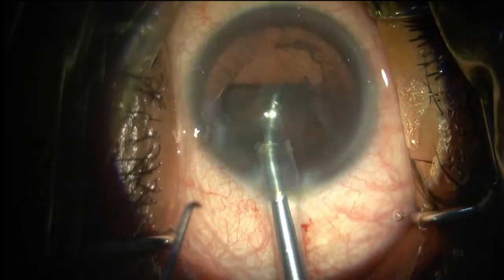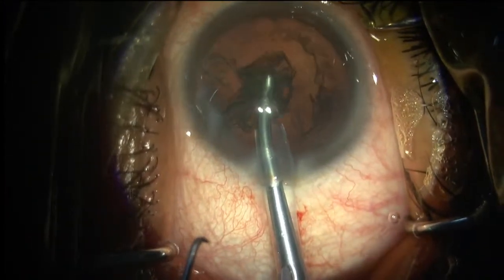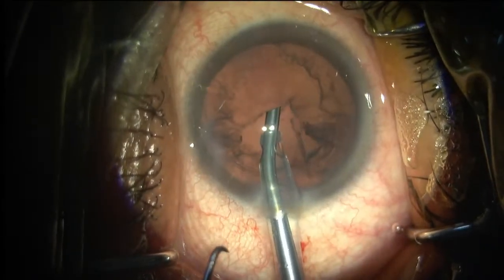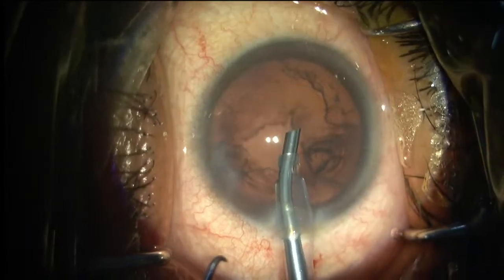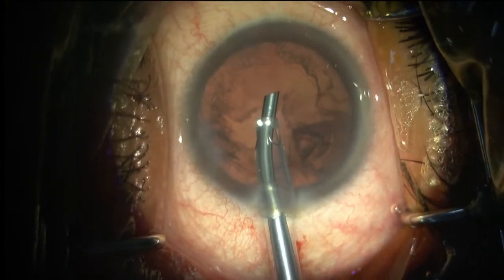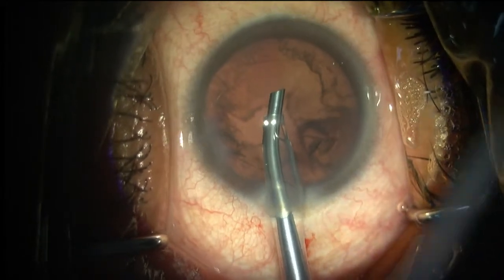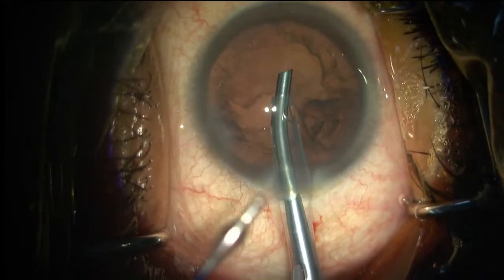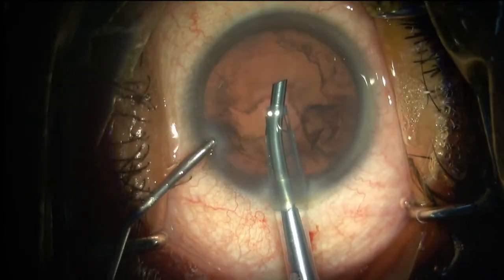No, I continue with the same parameters. Only thing, I've removed the chopper so that there is no leakage from the side port, and I kept the tip horizontal instead of keeping it vertical. By any chance, if the posterior capsule comes forward, it won't hit the tip. Only if the epinucleus is.